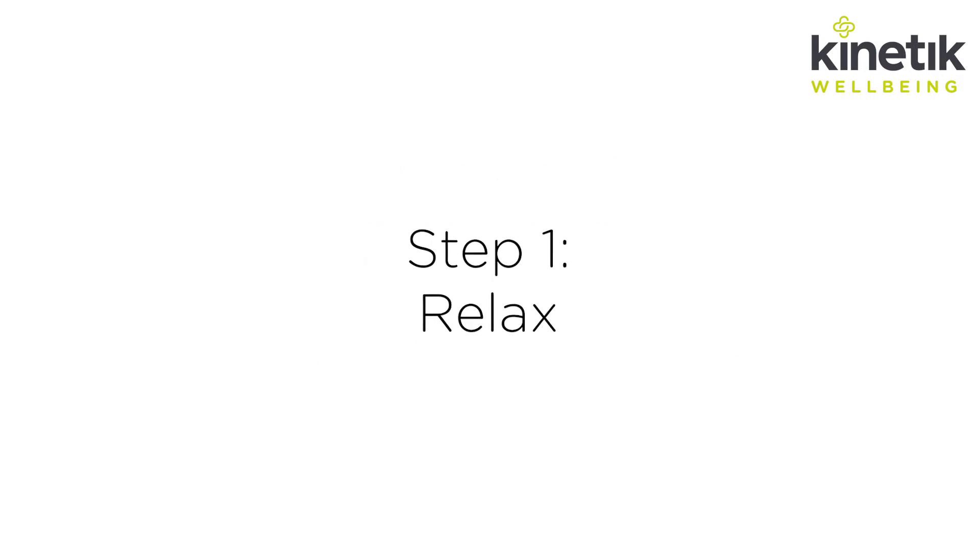Step one: relax. Rest for five minutes before taking your blood pressure. Don't eat or drink anything beforehand.